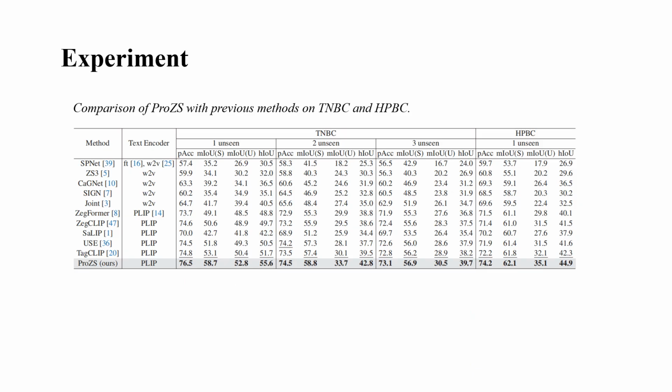We finally discuss the effectiveness of our ZSS model ProZS. We compare ProZS with SOTA methods for the ZSS task. From the table, we can see that ProZS achieves superior performance for tissue segmentation, particularly on the unseen classes.